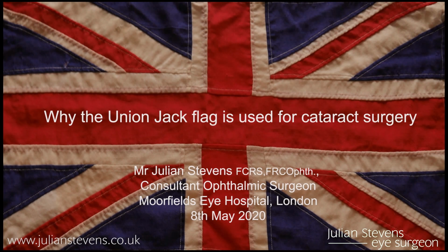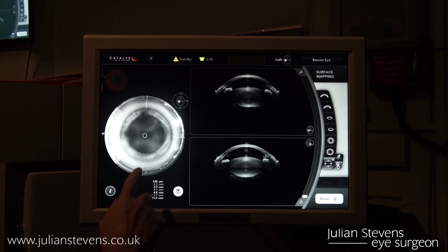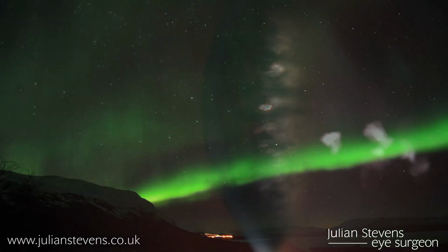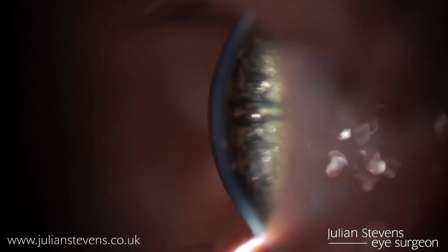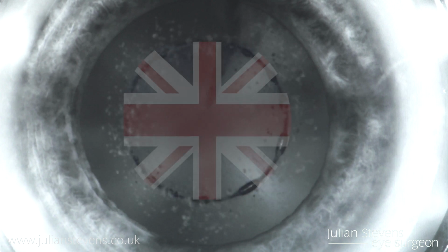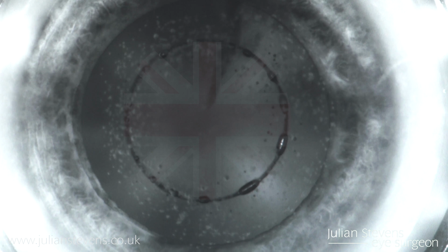In the 21st century, we now use lasers to precisely disassemble a cataract within the eye. The laser creates a plume which is similar to the aurora borealis. The first stage of laser cataract surgery is to create a precise circular opening at the front of the lens, and then a Union Jack pattern is applied to the cataract.